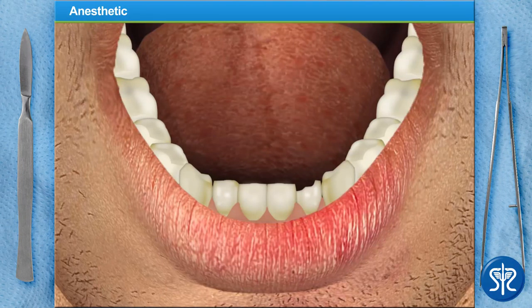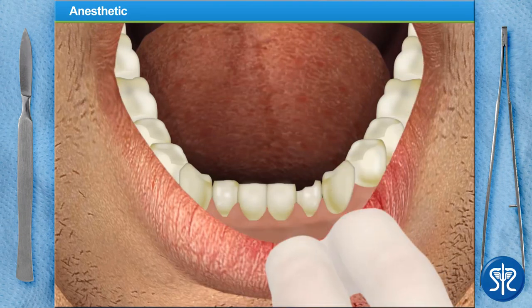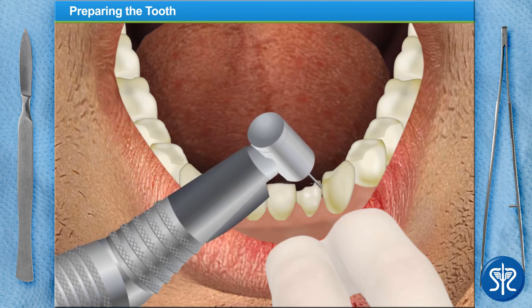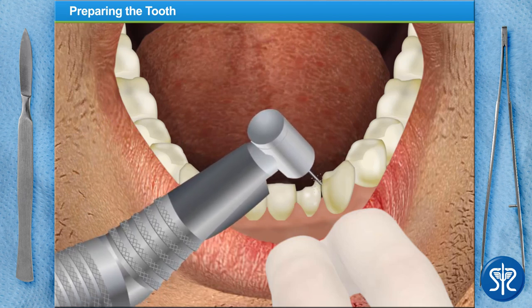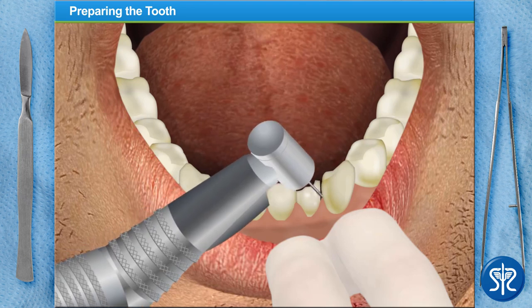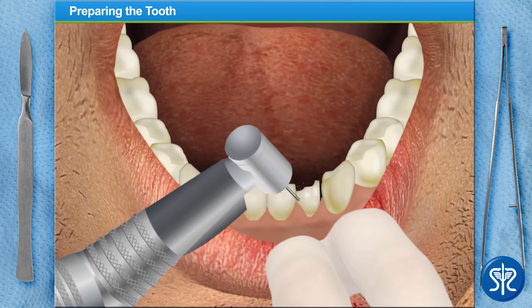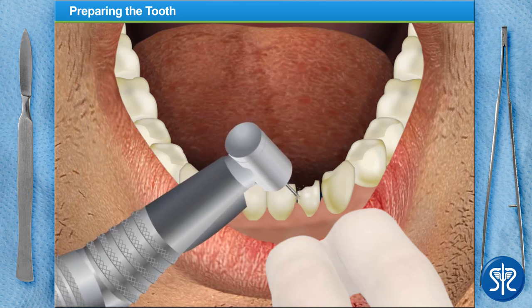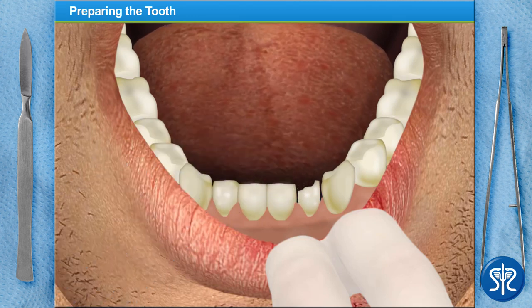Now that the area has become completely numb, we can move on to preparing the tooth. To begin, we'll reduce the size of the tooth, cutting it away from the adjacent teeth — go ahead, give it a try. It looks good, but we need to create a more tapered top to the tooth; this will allow for a more comfortable and exact fit for both the temporary and permanent crowns.